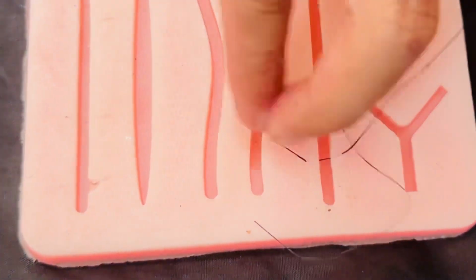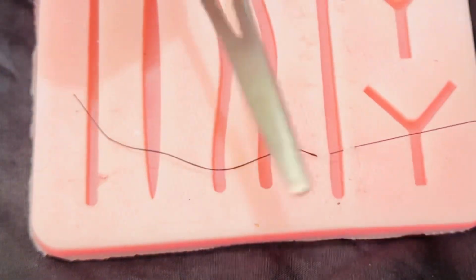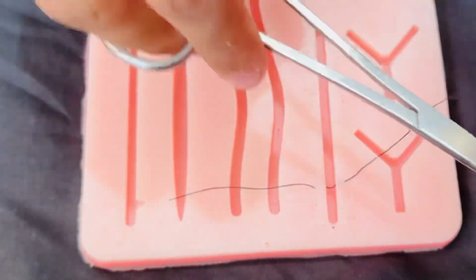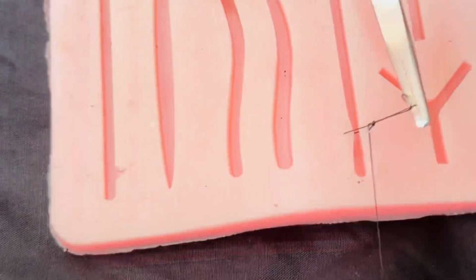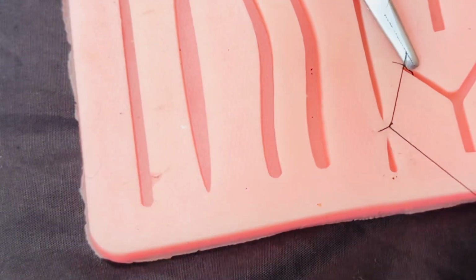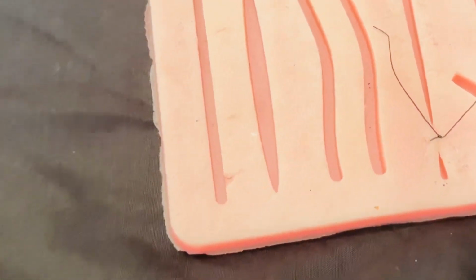Yes, you have heard it correctly. I said surgical knot. A surgical knot is not like a simple knot you give at home. It is like twisting or rolling the thread upon the artery forceps twice and then grasping the end point of the thread. And keep in mind that you should always give 2 to 3 knots, otherwise the wound will not close properly and the stitch loses its tensile strength.